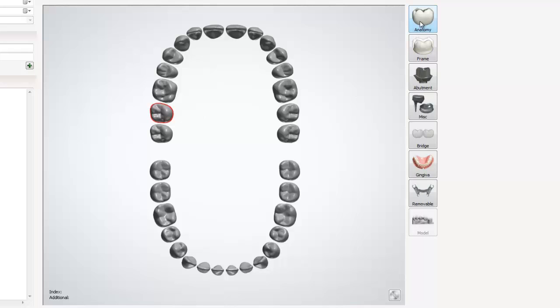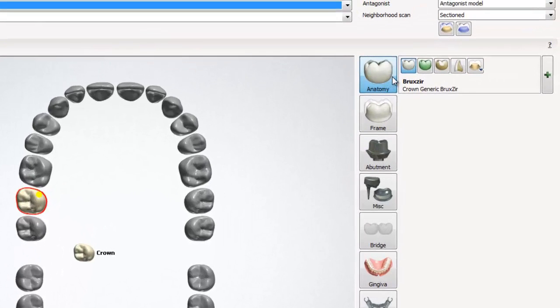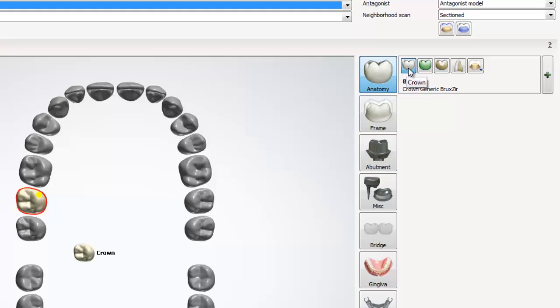Now that we've chosen a tooth, we can tell 3Shape what material and type of restoration we are going to produce. For starters, let's take a look at the anatomy option. To do this, we go to the right hand side of the screen and left click on the anatomy button. This will bring up a submenu within anatomy. Now that we have the submenu open, we can see the other options we have within anatomy. The default option is crown.